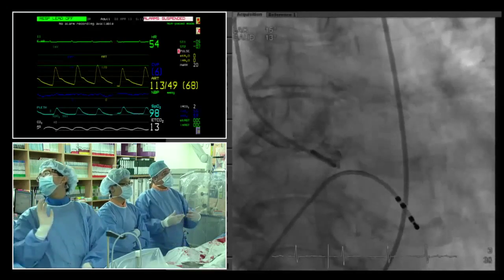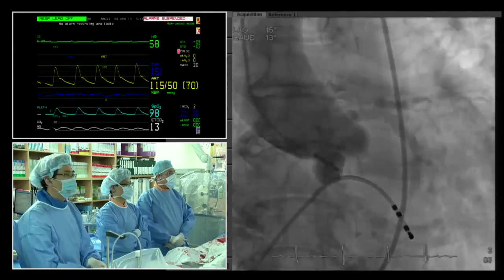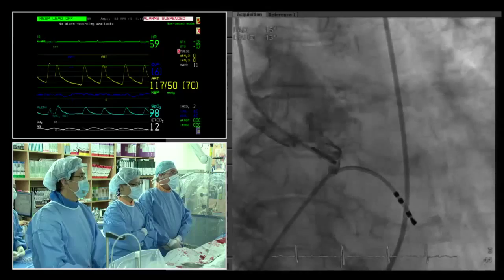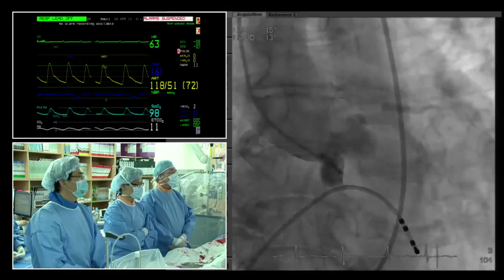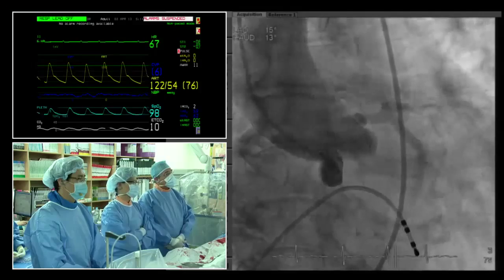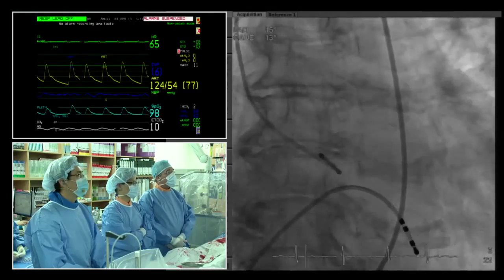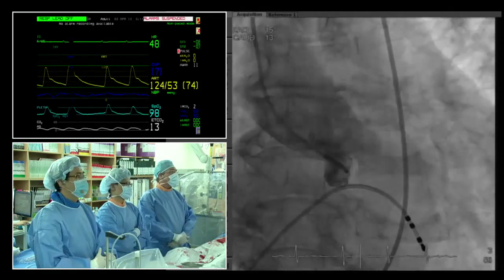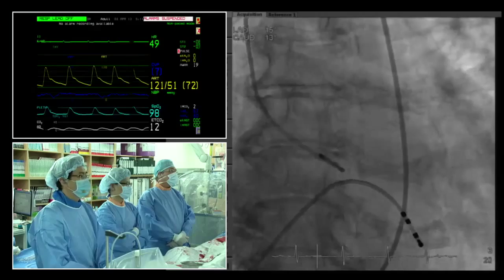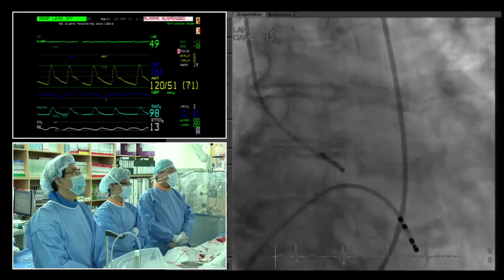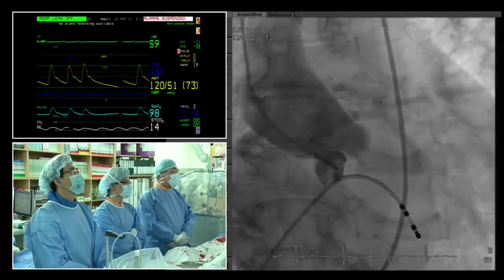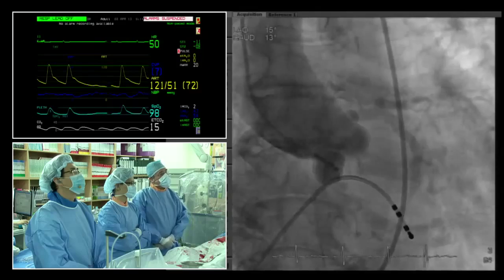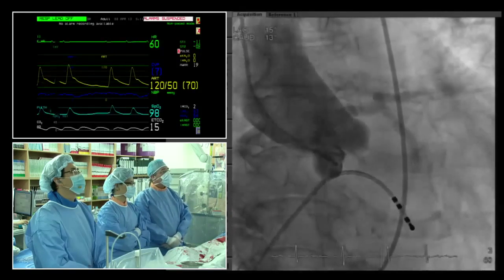Looking at the angiogram, the aorta is a little dilated as well. The 23 valve upper part is 35 mm compared to 43 mm for the 26, so we could have better fixation at the upper part with the 26 rather than the 23. This is a minor but important detail. The risk of paravalvular leak is most likely not an issue here if we implant correctly, because there is not too much calcification.